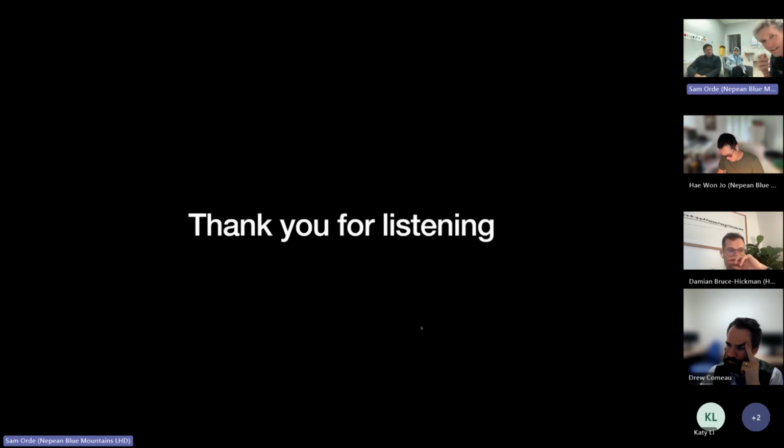Yeah, great question. Did you guys hear that? I think it's a really important question. I think it's going to come back to a philosophy. I love echo. I think it's amazing. One of the things that worries me is, and I'm sure we've all seen examples of where echo has caused harm. And it causes harm because we haven't integrated an echo finding appropriately into a clinical scenario. So I think we must be using our clinical acumen and then using echo to back that up. I've got that saying in my head: echo can make a good doctor great and a bad doctor dangerous.